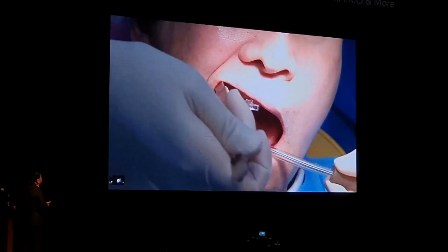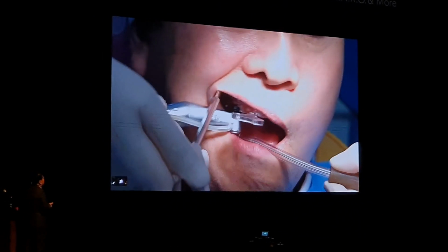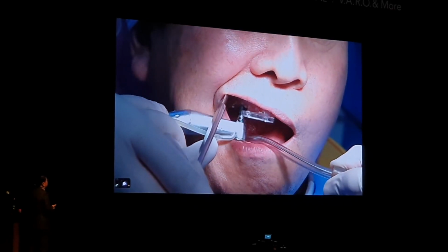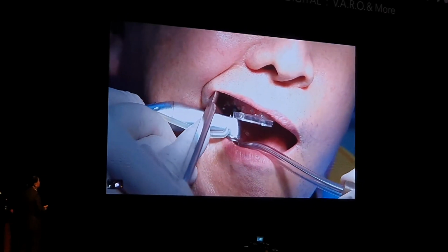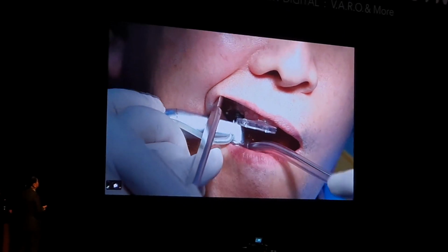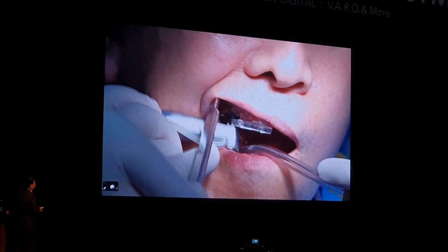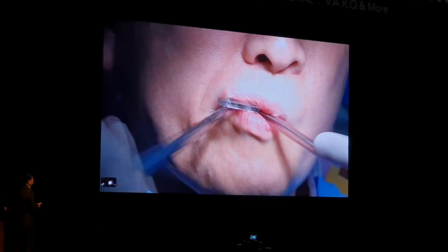Yes, I think you got there. So let me check once more. Slightly more. Yes, a bit. Okay. Good. So if you need me to check, shall I?